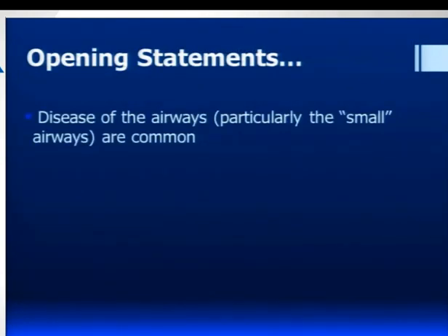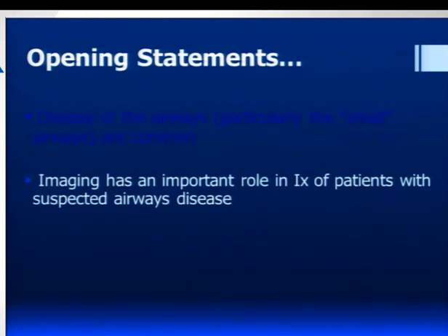So I think it's fair to say that diseases of the airways are particularly common. As I hope you'll see, diseases of the small airways are incredibly common, and we encounter diseases of these airways very frequently in our clinical practice. I suppose as radiologists, this second statement has to be in there.